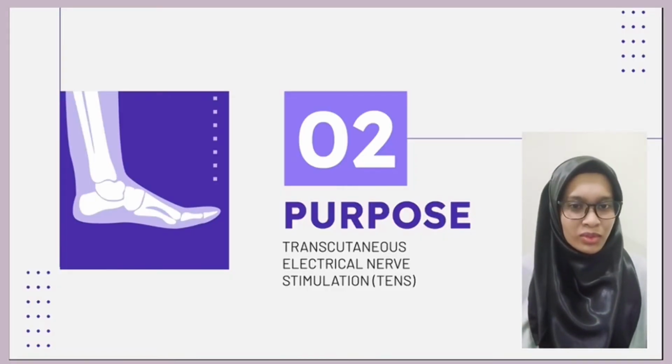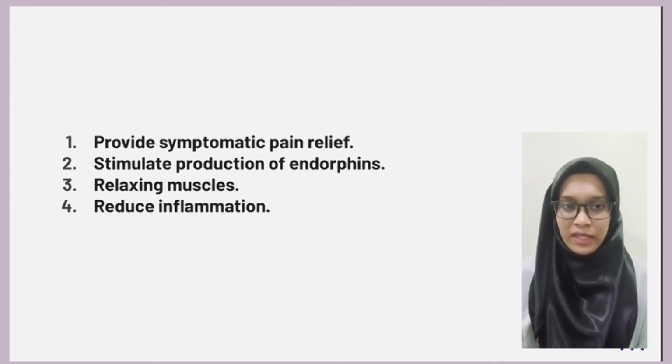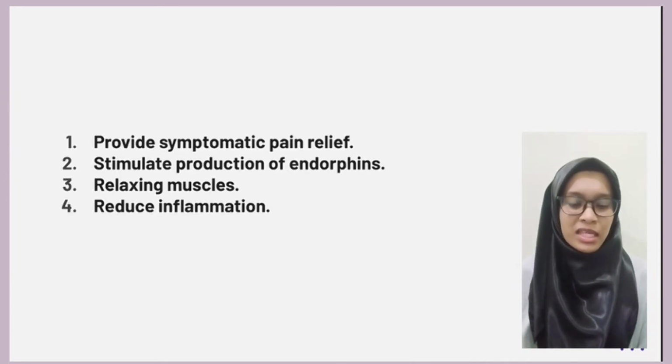Now we go to the purpose of transcutaneous electrical nerve stimulation, TENS. So, there are a few purposes of using TENS for carpal tunnel syndrome. First is to provide symptomatic pain relief. Second, to stimulate production of endorphins. Next is relaxing muscles. And the fourth one is reducing inflammation.